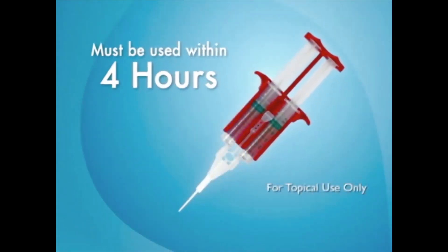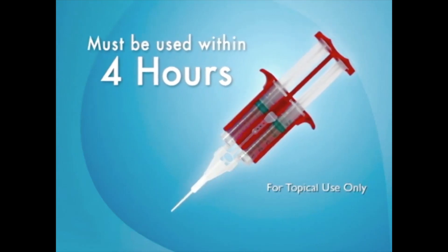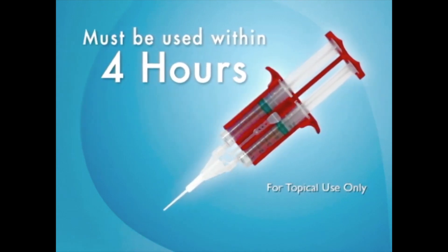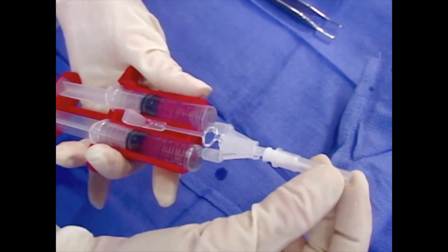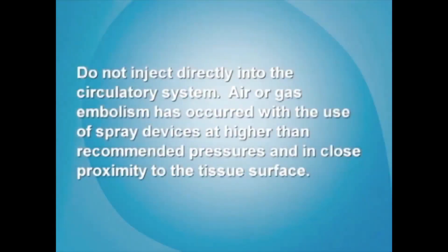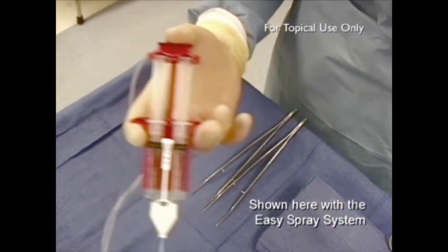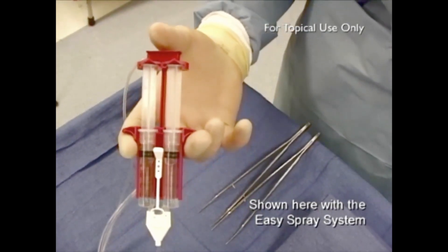Once reconstituted, the Tisseal Fibrin Sealant kit must be used within four hours. Do not refrigerate a partly used syringe. If the product is not used within four hours, it cannot be used and must be destroyed. If the cannula tip or joining piece clogs, replace with the spare joining piece or tip provided in the Tisseal Fibrin Sealant package. Your Tisseal Fibrin Sealant is now ready to use. The wound surface should be as dry as possible before application. Apply Tisseal Fibrin Sealant to the wound area as a thin layer and repeat if necessary before the previous application is fully polymerized.